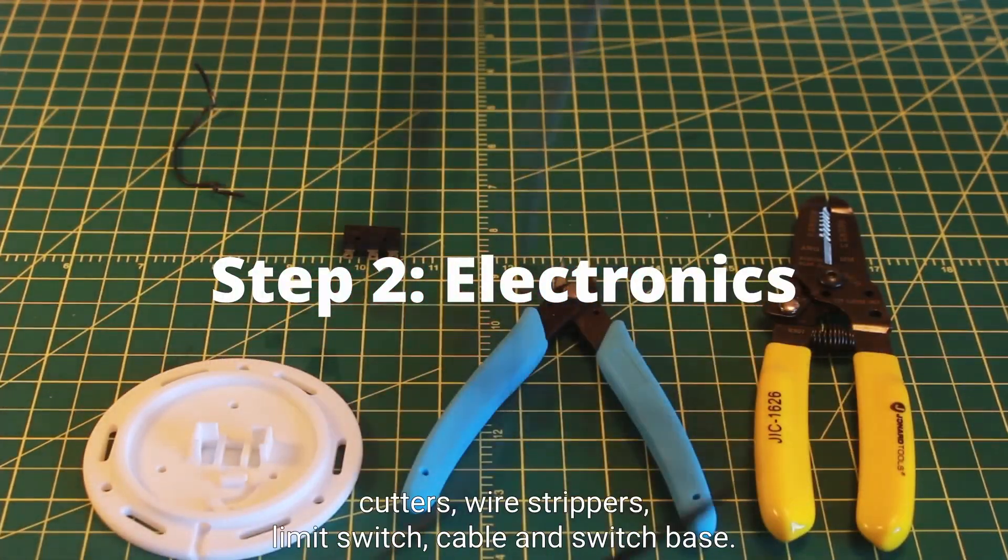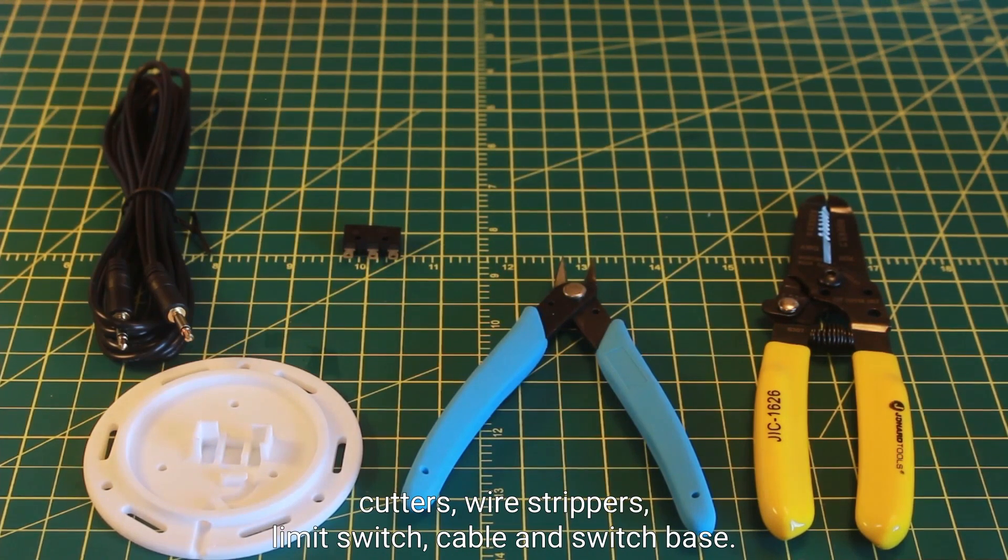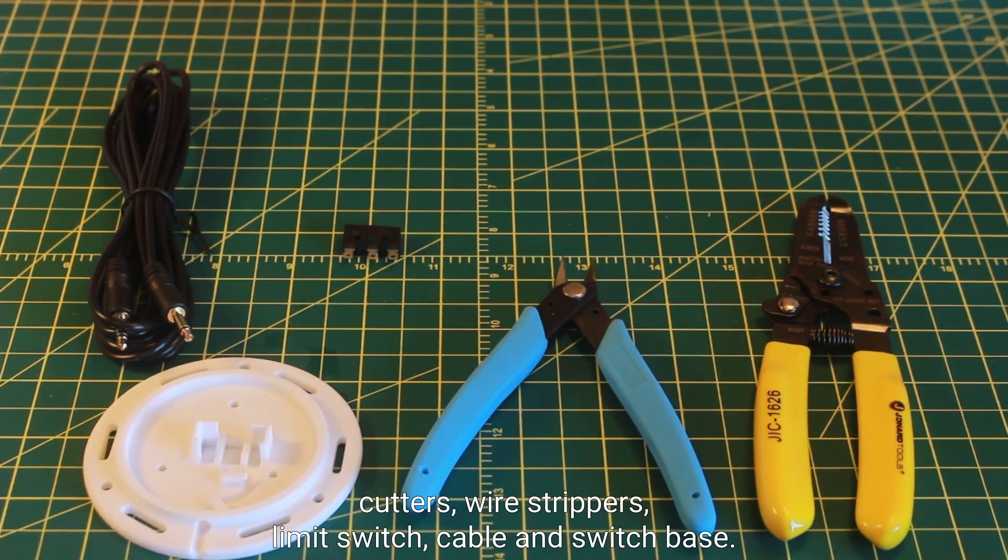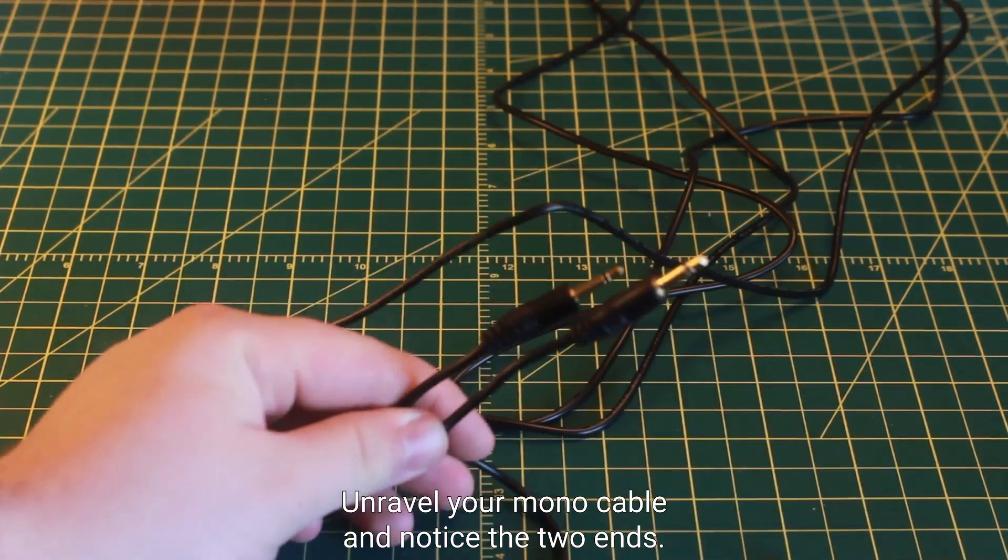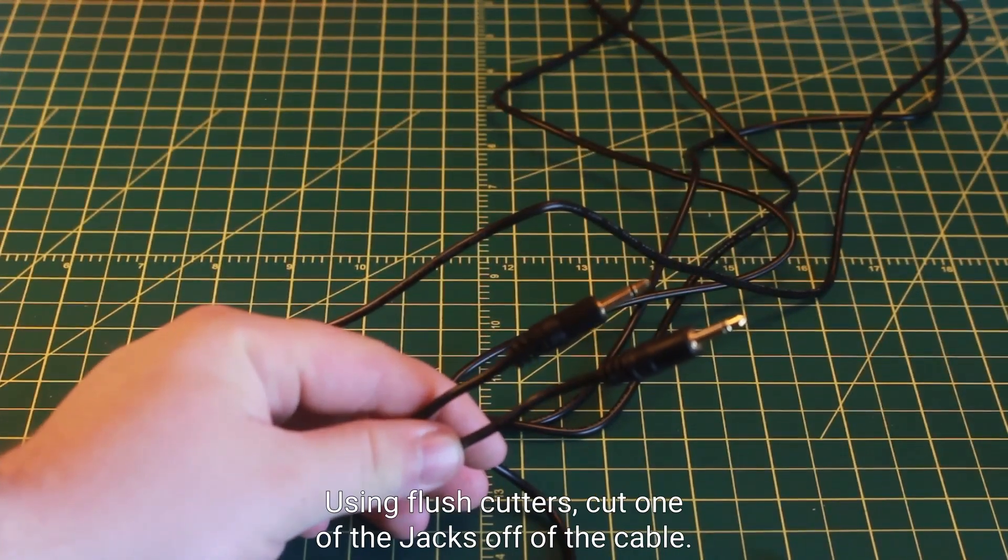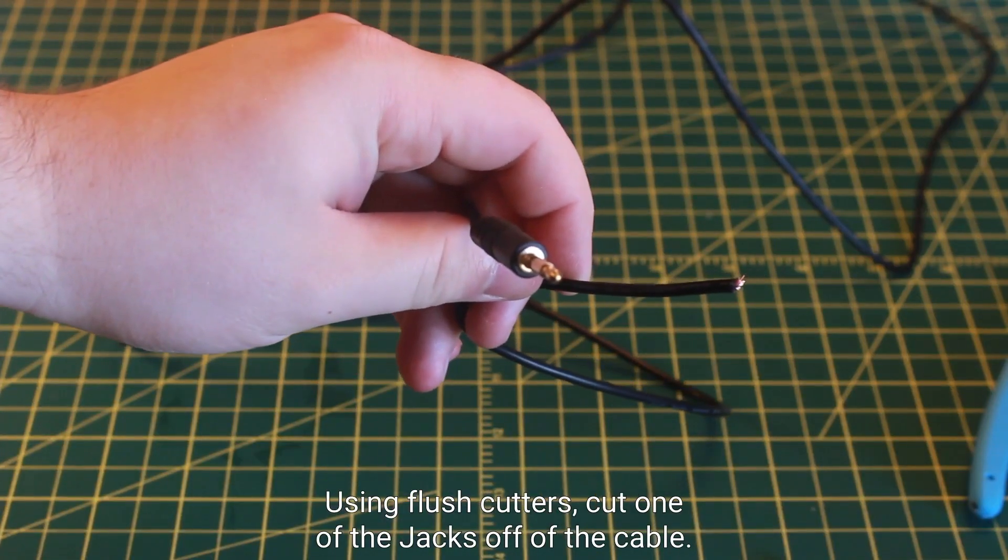For this step you'll need your flush cutters, wire strippers, limit switch, cable, and switch base. Unravel your mono cable and notice the two ends. Using flush cutters, cut one of the jacks off of the cable.